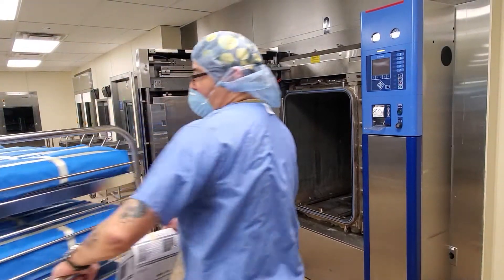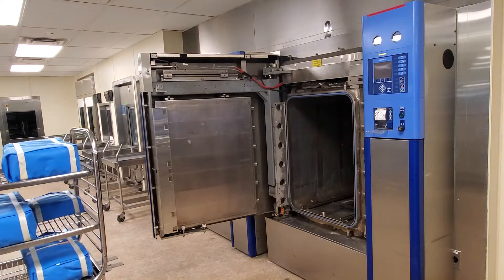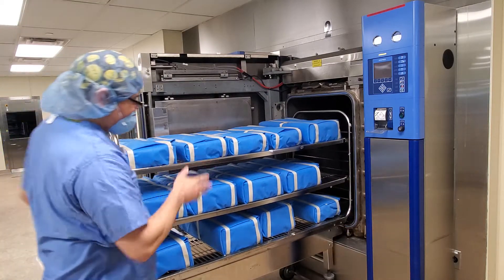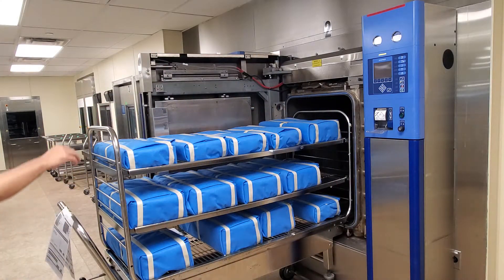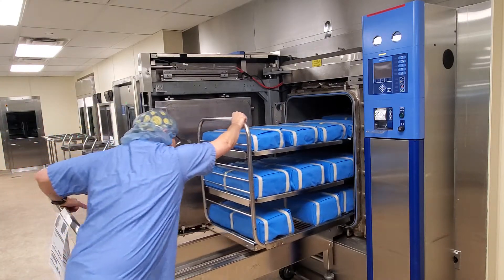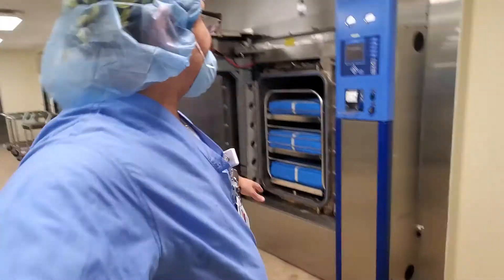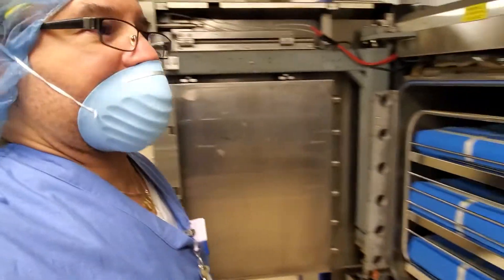We put it in there — inside the chamber. Line it up, you can see — line it up so everything is even. Now push it in. I push the bolt to close — you can see it's closing.